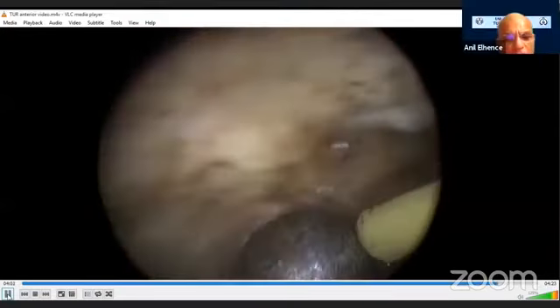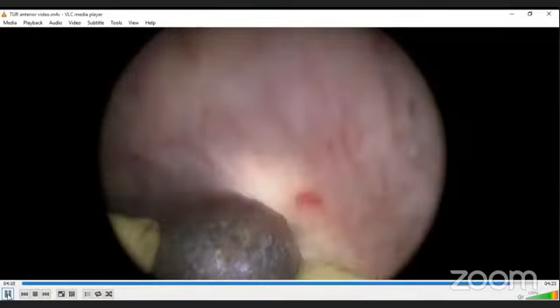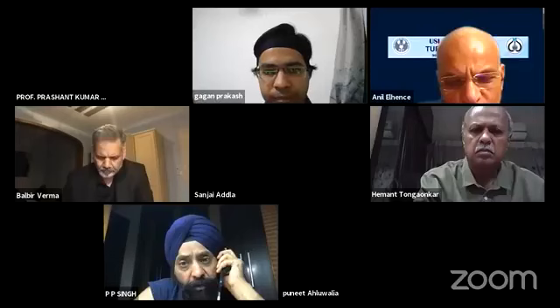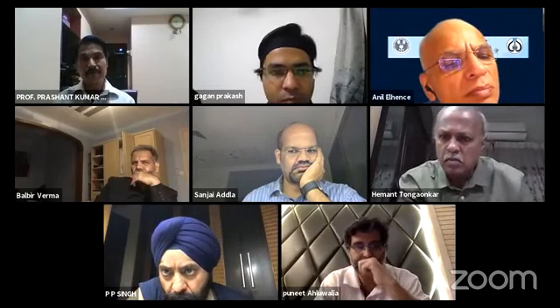Two questions, Ganesh. Yes, Jitain sir had just made a comment a couple of presentations back that he starts from the middle rather than from the edge. I feel that starting from the edge, you get an assessment of the depth where the normal bladder wall is. So, what is your view on that? So my take is that if the tumor is absolutely varied in size, then it is worth sometimes taking some cuts in the center. Otherwise, I would always go from the edge, and it always seems better to go that way.